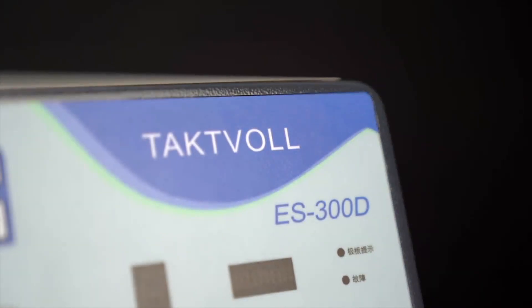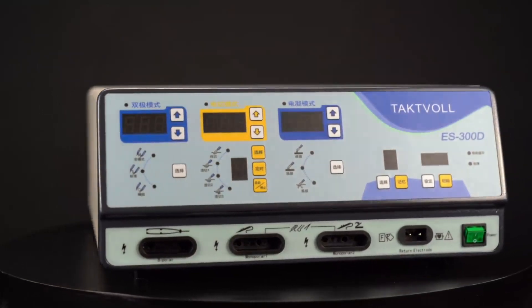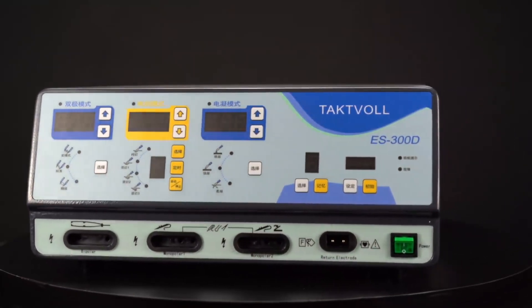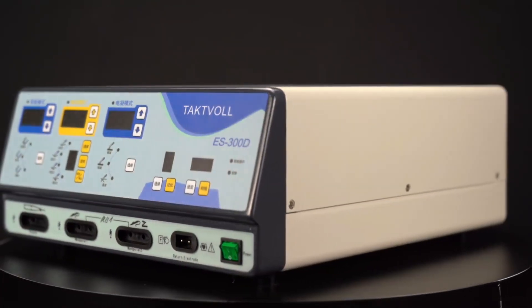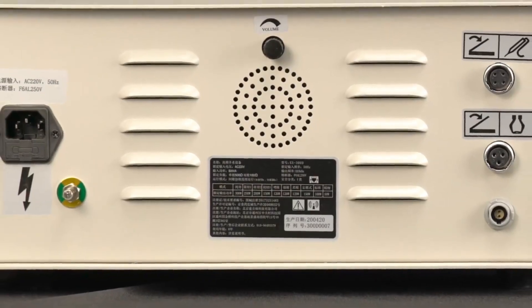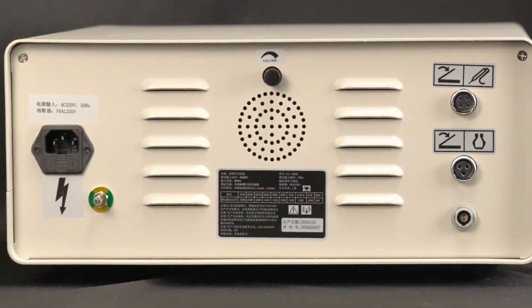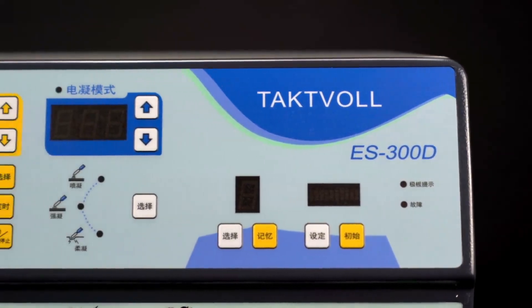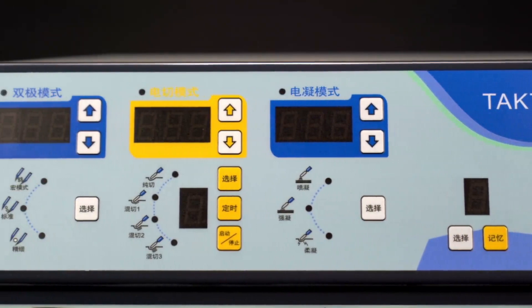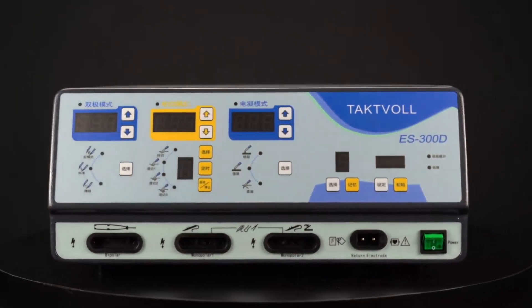The TactFall S300D intelligent electrosurgical unit is a multifunctional electrosurgical device with good cutting and coagulation functions. With powerful functions, streamlined user-friendly design, and proprietary technology for optimizing energy output, it can implement manual power adjustment for surgery and has a highly intelligent program to control output power, bringing convenience to the surgeon and reducing surgical damage to a lower level. The S300D has a compact size, simple and elegant appearance.